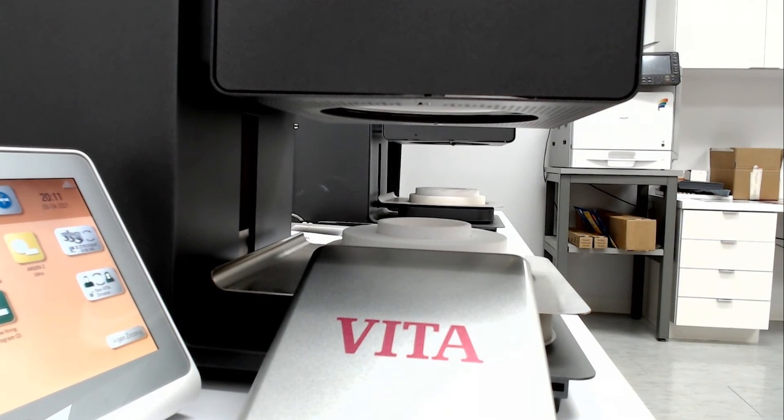Hi, this is Paul and welcome to another Vita Learning video. Today we're going to be talking about calibrating the Zircomat sintering furnace. This is for the Vita Zircomat 6000 MS or the Vita Zircomat 6100 MS.